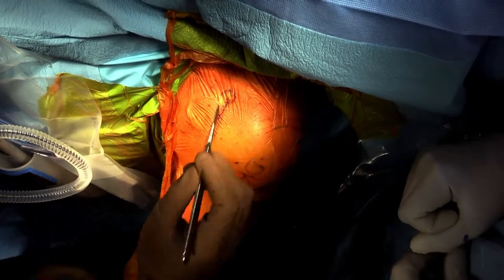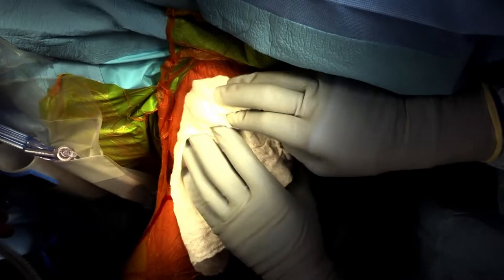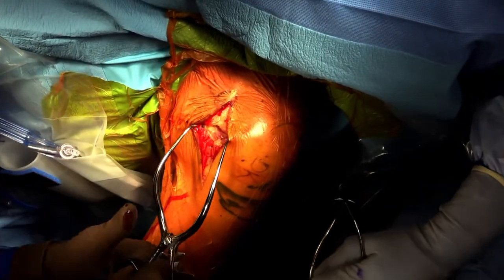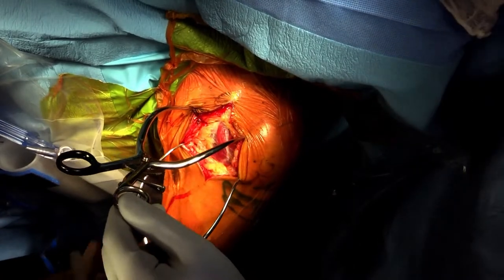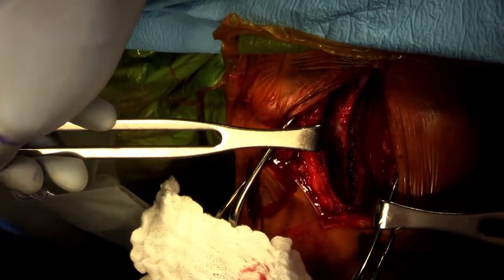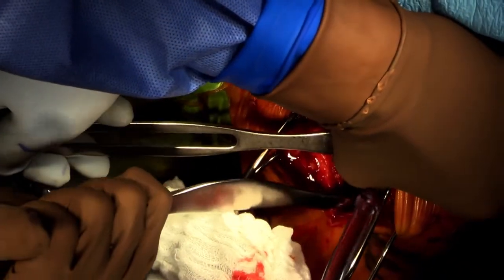Make the incision lateral to the axilla and right along the deltopectoral interval. Gelpis are placed within the subcutaneous layer. Enter the clavipectoral fascia layer lateral to the coracobrachialis muscle belly.